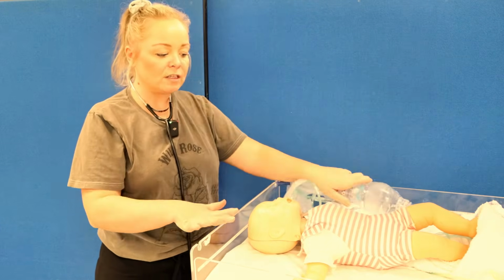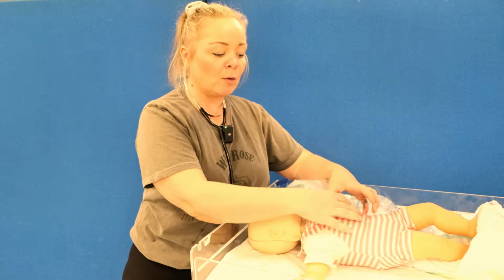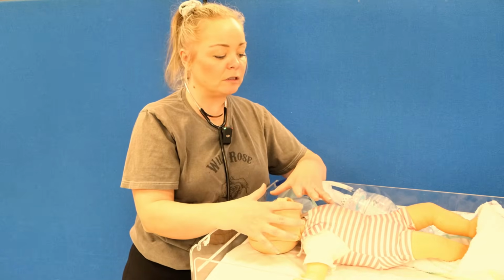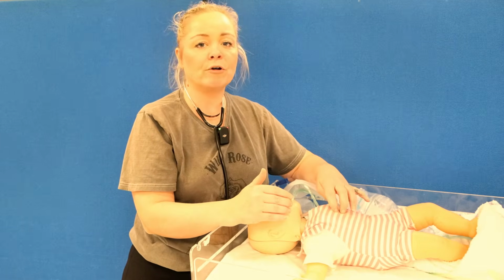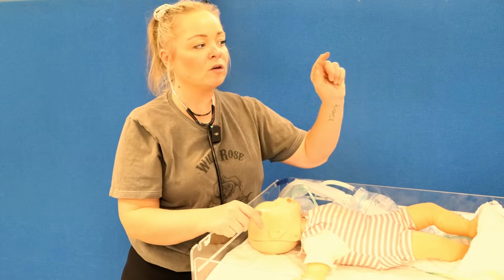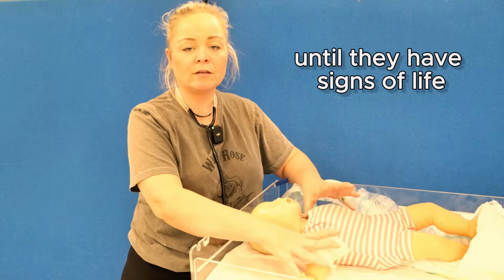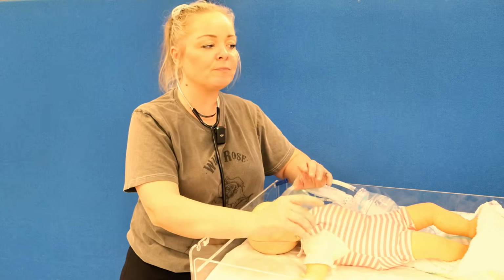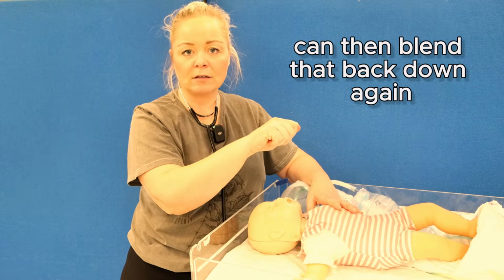The reason why we do this is we know we've pushed the fluid out, we've given the lungs some air, and we've tried to give the heart the best opportunity to get that air circulated. If we then need to start compressions, we know at this point the infant might be becoming hypoxic. So we turn the blender up to 100% oxygen until they have signs of life, and then the neonatologist team, the team that come to support, can then blend that back down again.